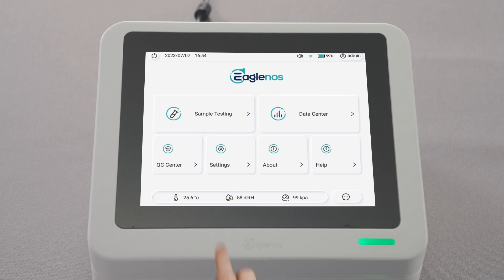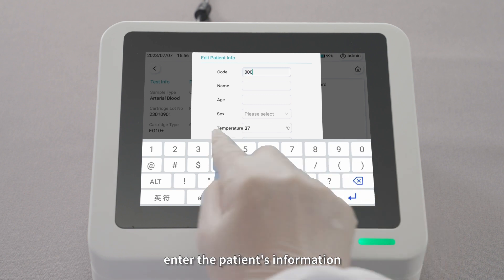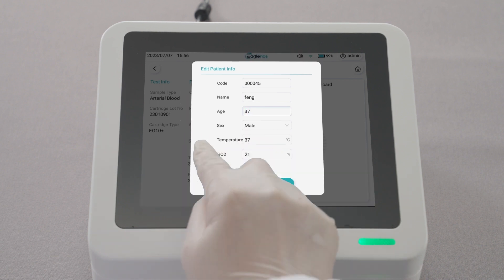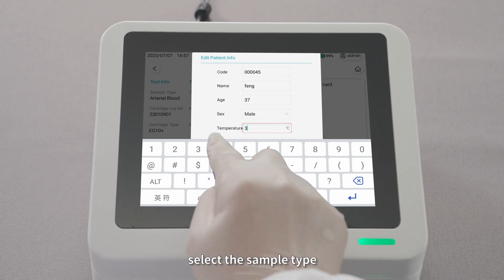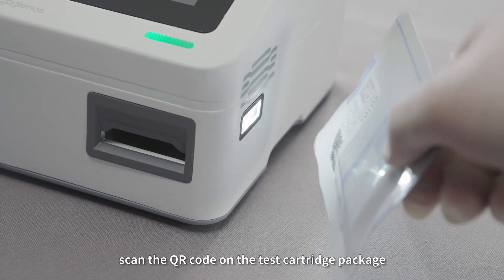Step 2: Testing Preparation. On the main page, click Sample Testing. Enter the patient's information. Select the sample type and click Scan. Scan the QR code on the test cartridge package.